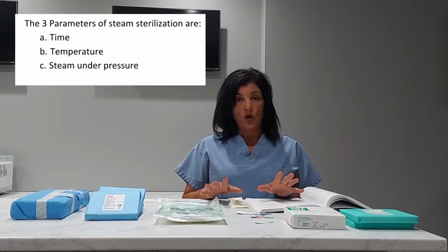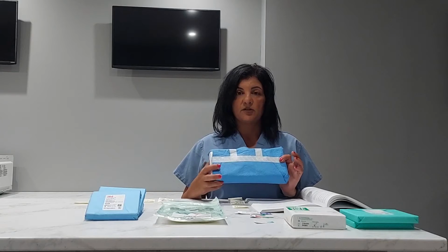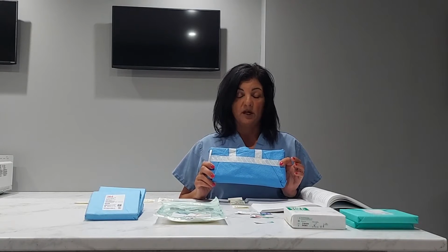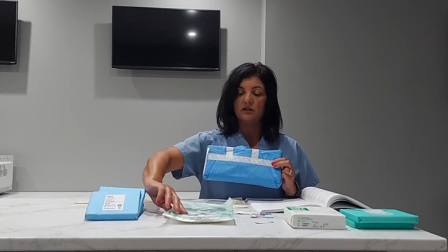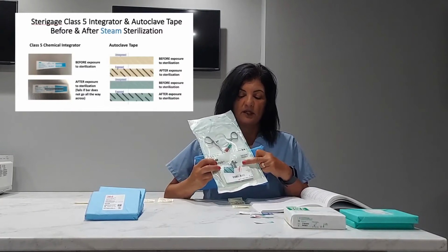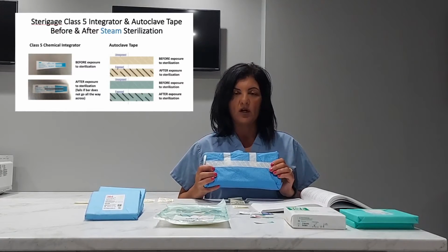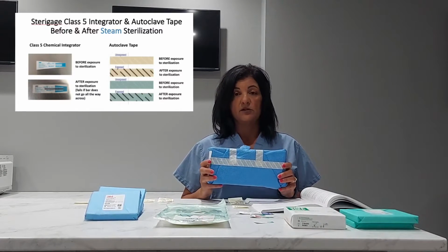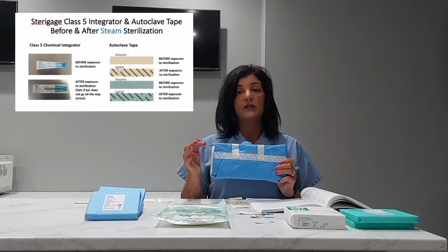So your class 1 is your exterior steam tape. There are many different brands on the market. There's the cream colored, there's your green color. There are different colors of tape, but they start out one color. Once they've been exposed to sterilization, they are reacting to being exposed to temperature or heat.